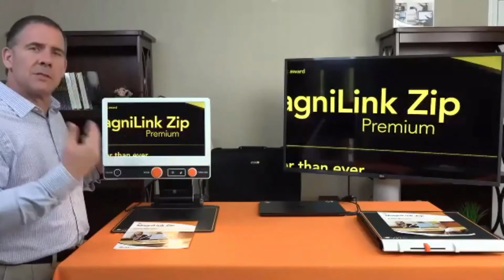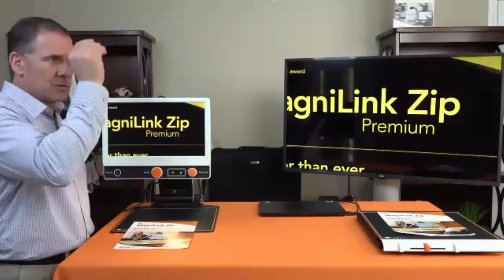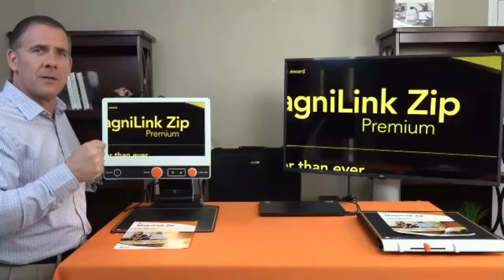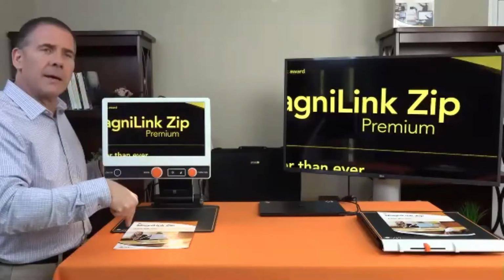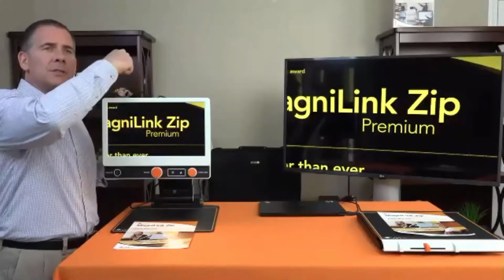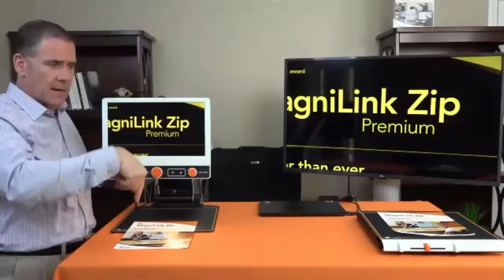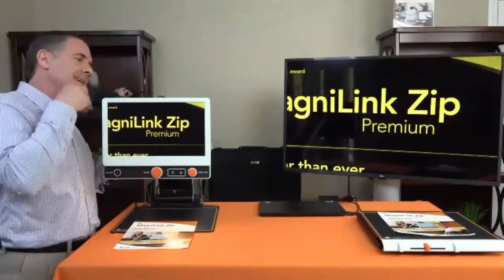This thing, once it's set up, I'll show you when I do distance. It knows what I like in distance magnification, what I like in looking at document magnification. So in the camera system here, and I'll show you, it does self view, distance, or document view. And it does a lot more.